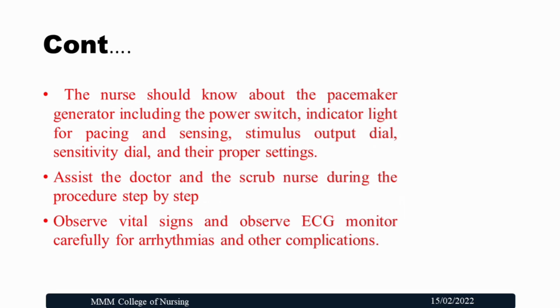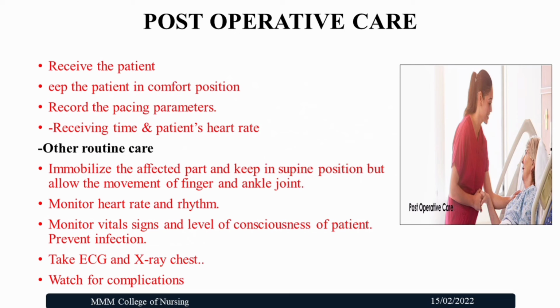Post-operative care is receiving the patient, giving the patient a comfortable position, and recording the pacing parameters, the time and the heart rate. Other routine care is immobilization of the affected part and keeping the supine position, but allowing movement of the fingers and ankle joint. Monitor the heart rate and rhythm, vital signs and level of consciousness of the patient, prevent infection, take ECG and chest X-ray, and watch for complications.